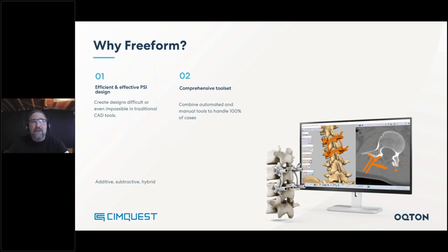We did have a surgeon who was actually using an automated solution for one of their projects. It failed repeatedly. They tried several times, and luckily they had someone that they knew who had Freeform, and he asked them if he could actually take a look at the job in Freeform, and he turned it around in very short time. So it's not unheard of that going to Freeform is the right choice and a great solution.